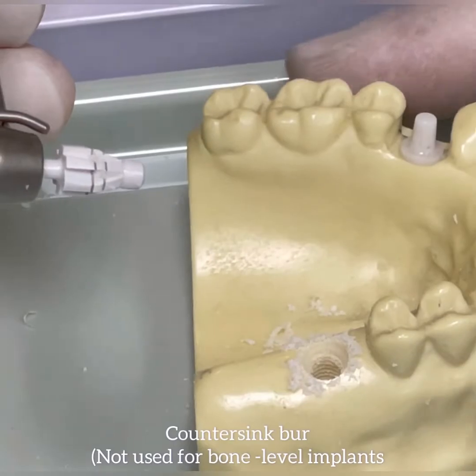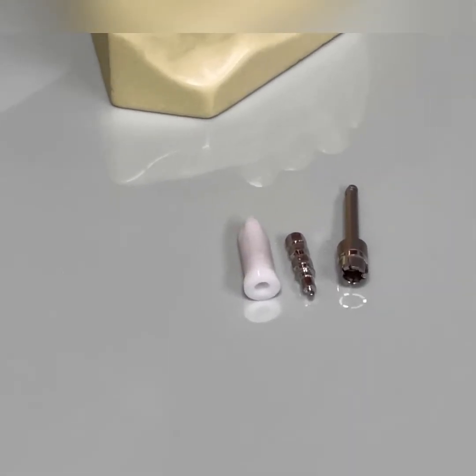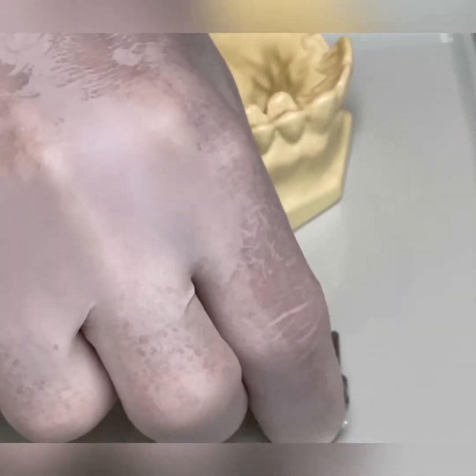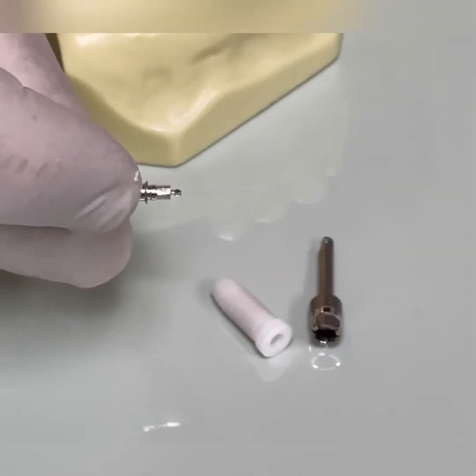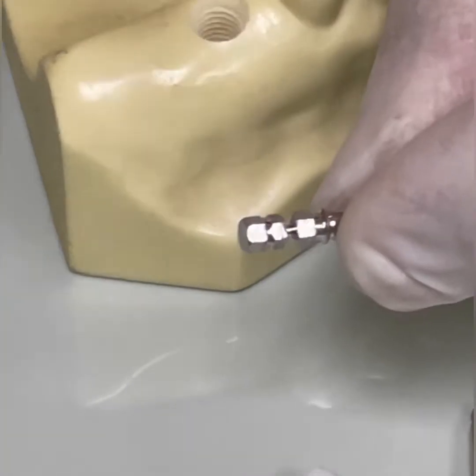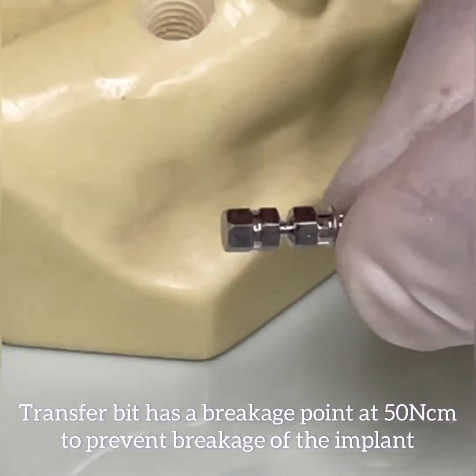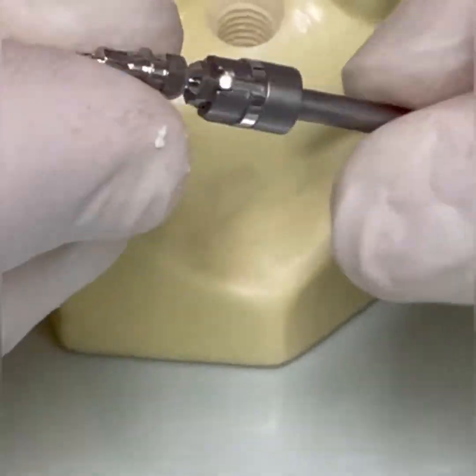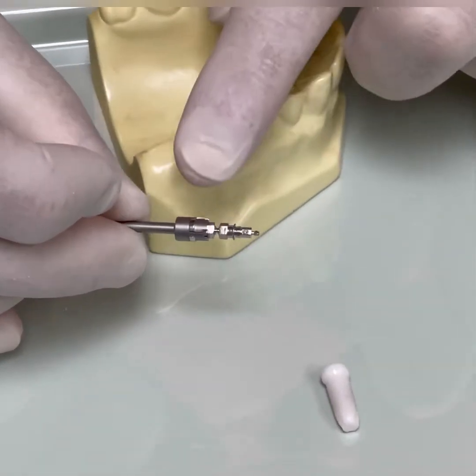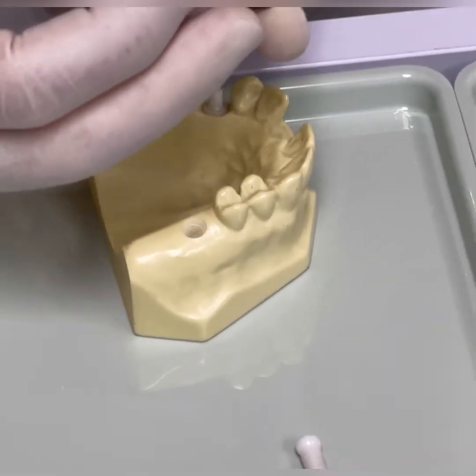I didn't really go too far with the countersink — it was barely a millimeter or two. So now we are ready to place the implant. After irrigating the socket with sterile saline, we have the transfer bit that comes in every single package with the implant. This transfer piece has a breakage point which will break if we exceed the torque settings. This hex goes into the adapter, so the transfer piece is now engaged in the adapter, which is a contra-angle adapter.